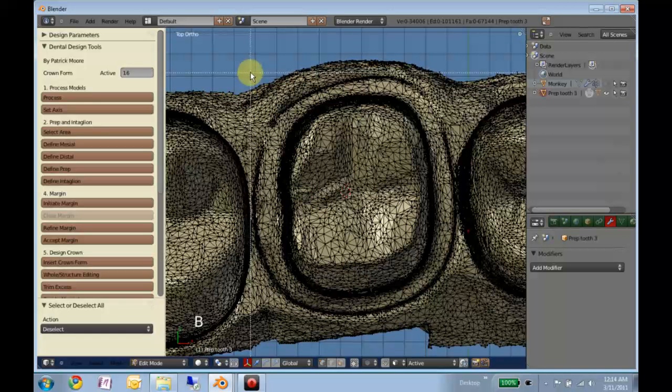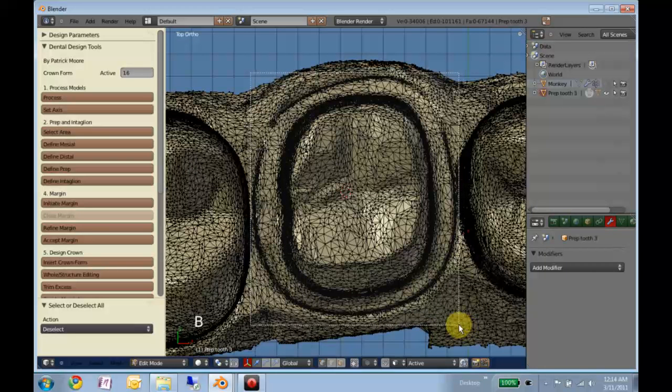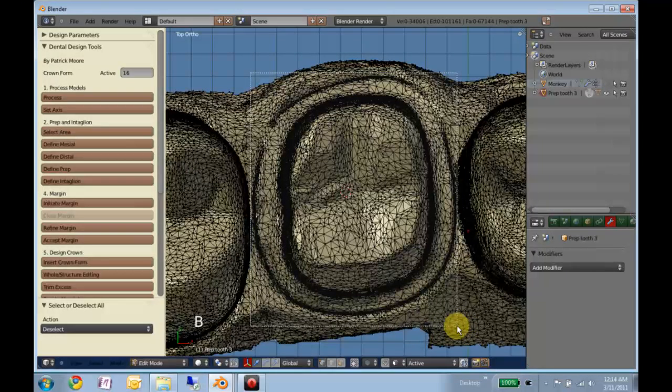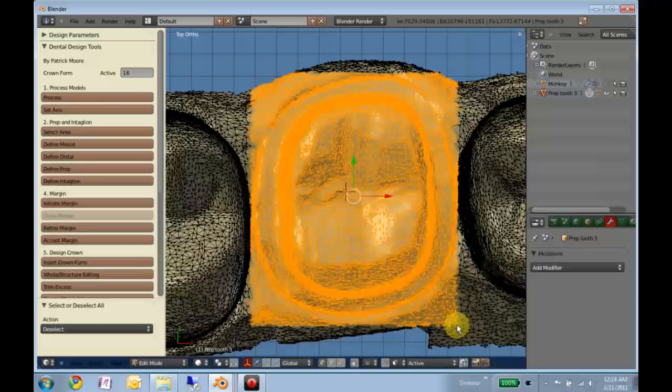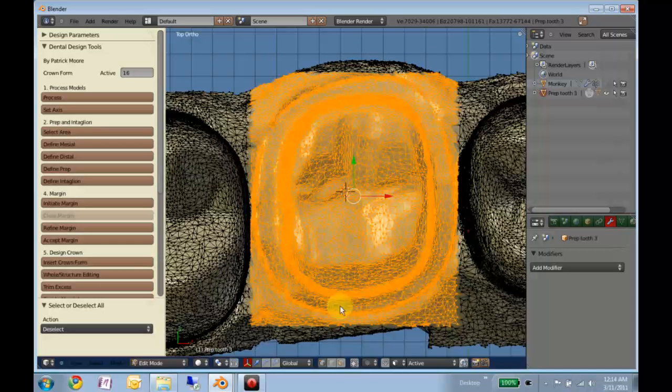And conveniently, this prep does fit in a box like this. So I can use the border select to select it as well. But normally you might have to use the circle select to kind of get into the contours.